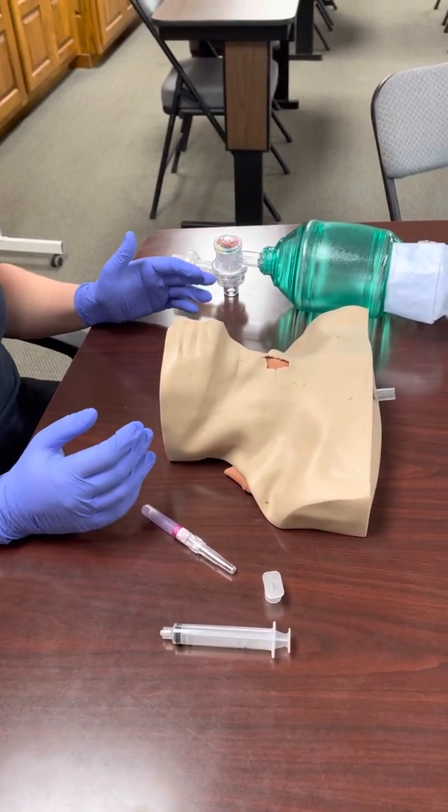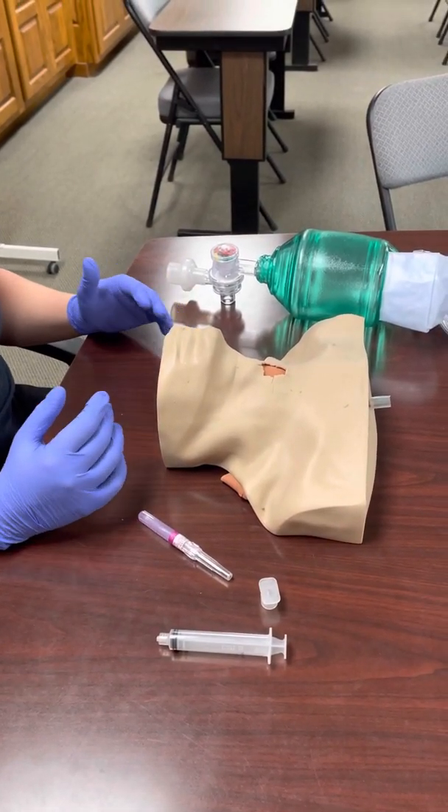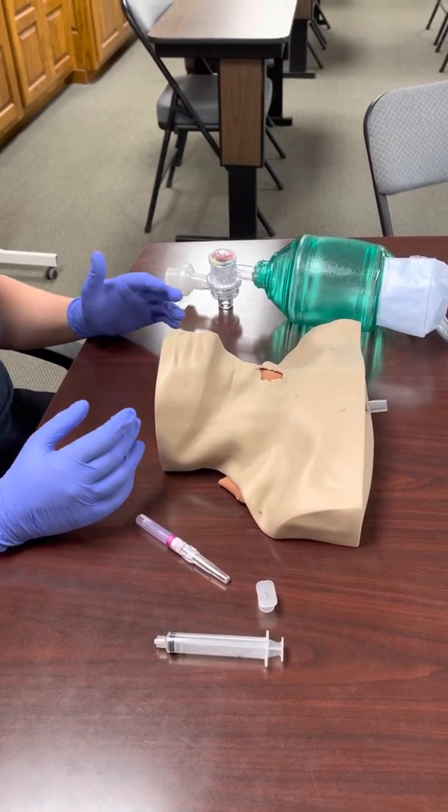Needle cric is a good backup method. It's a little bit easier to do, it causes a little less bleeding, and it's a little bit easier to hit your target.